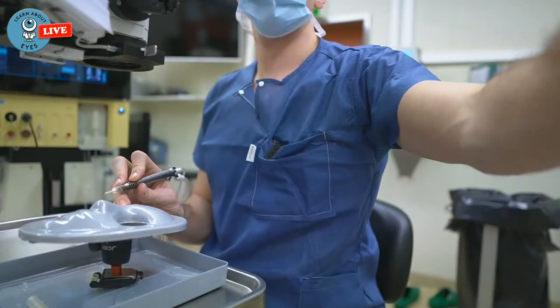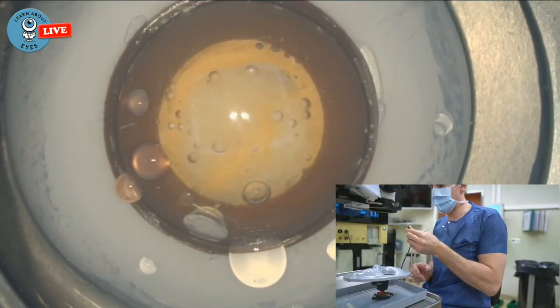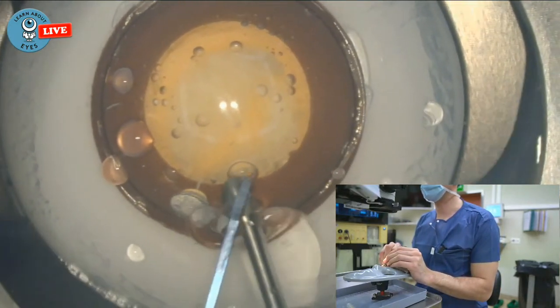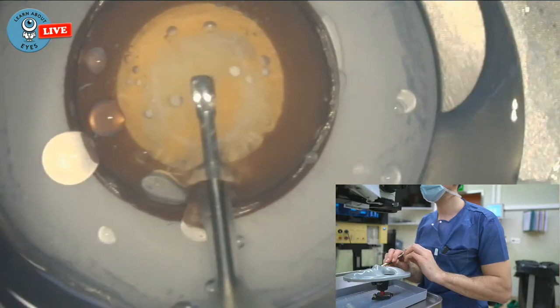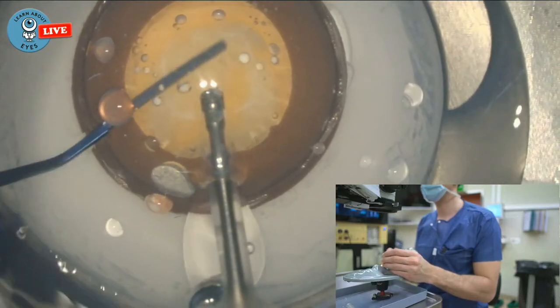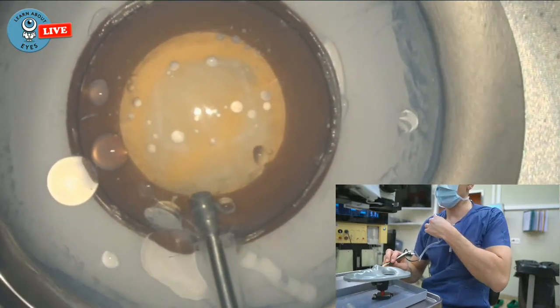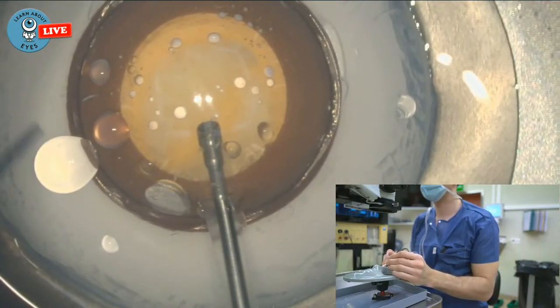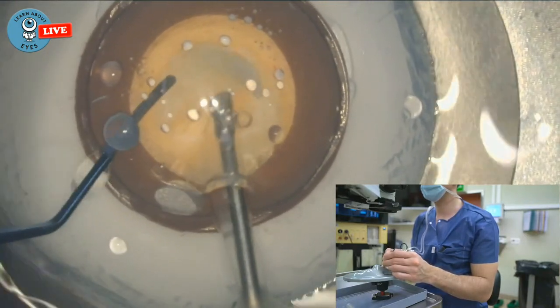All right, so let's go back to the microscope view, and this has gotten really sticky. So again, I'm using the spatula to go in, turning, and now we do have these two halves that we're going to try and get. And again, bubbles everywhere, and this is annoying me. It's coming straight from here. Okay, so let's try and suck them up here.